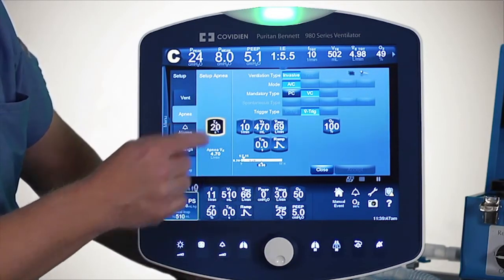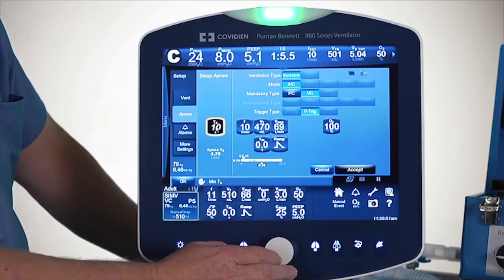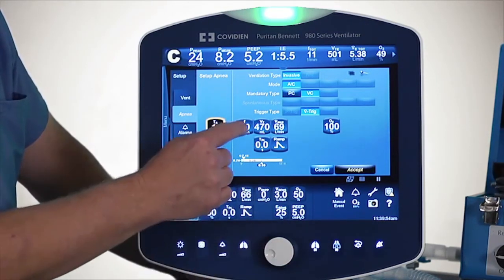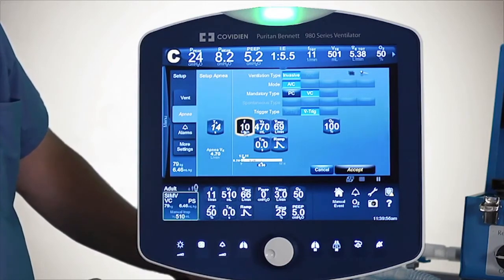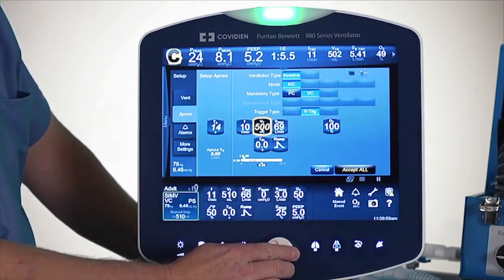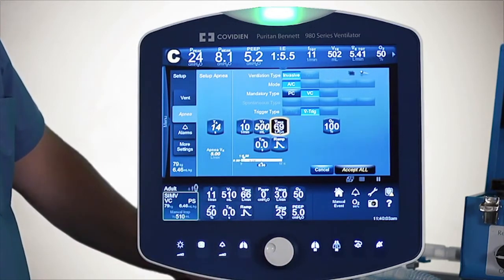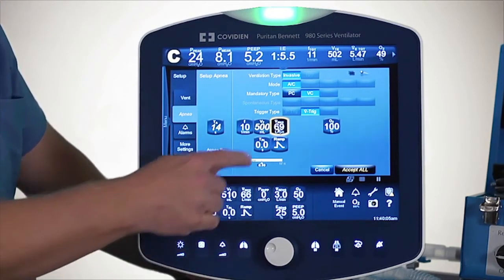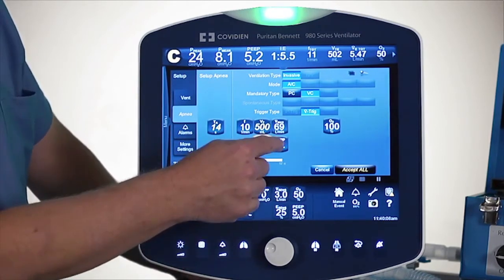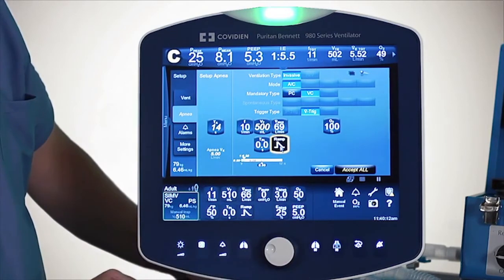In terms of delay time, how much delay time do you want? I can adjust that down to 10 seconds. What kind of backup apnea rate do I want? What kind of tidal volume — so maybe I'll set that to 500. What kind of flow do I want to set? Do I want any kind of plateau, as well as a certain type of flow pattern?